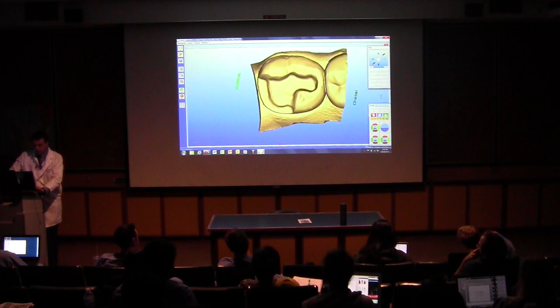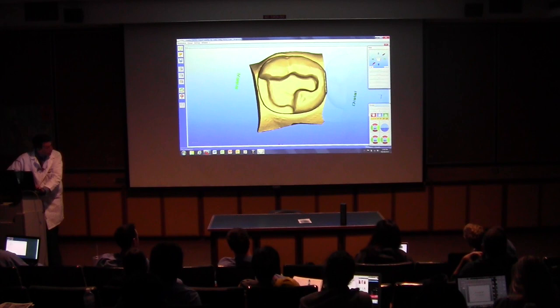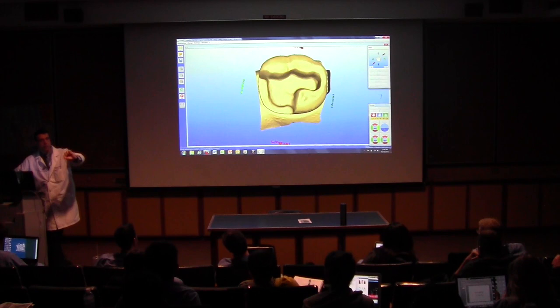Double click. There we go. I have my die now. Do you see here on the left side, next? I'm going to click on next here. Guess what? My software is now asking me to enter the preparation margin, and you also see automatic margin finder. What you're going to do here is design or draw the margin and show the software where your margin is.